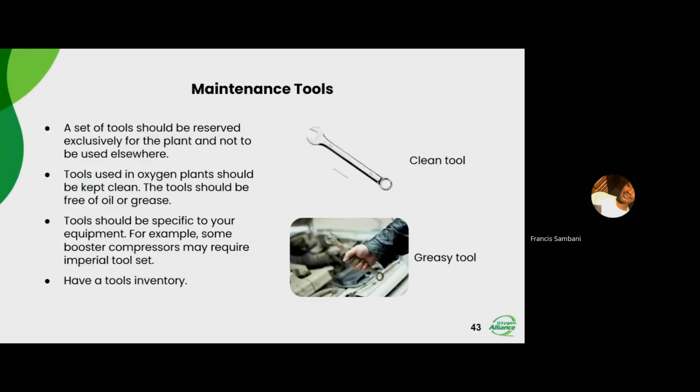And then on you maintaining your tools, is a very good thing for your PSA plant. So first, we recommend having a set of tools reserved exclusively for your PSA plant, and not used elsewhere. But if you have to, which we don't recommend, make sure that you have them cleaned each and every time. Even though they are exclusively for the plant, you also have to clean them each and every time.